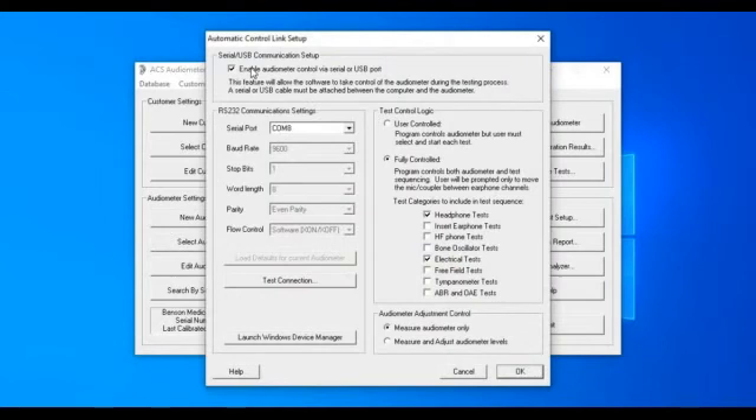This little box is checked because we know we have direct control of that audiometer. Here's the COM port — we may change that around a little bit. I can go back and test the connection, but I've already done that. I have the option here for user control or fully control, which is 90% of the time where it's going to be. Remember, this is used in manufacturing, so you can get a little more sophisticated with the system and change it around to suit yourself.